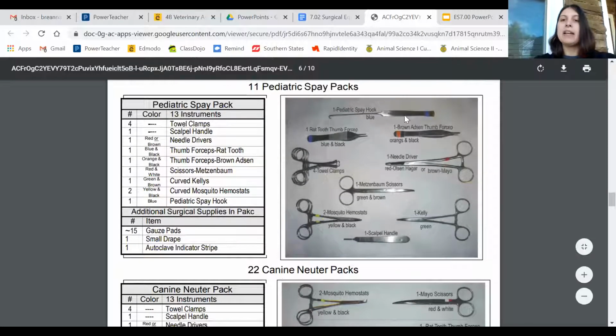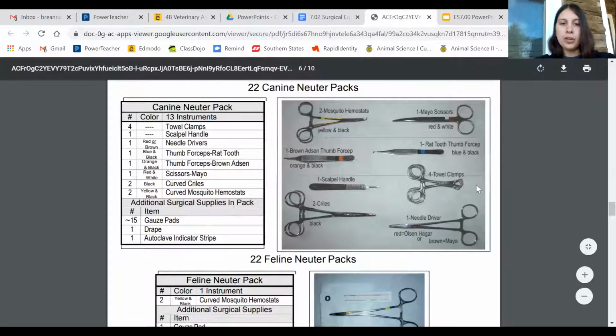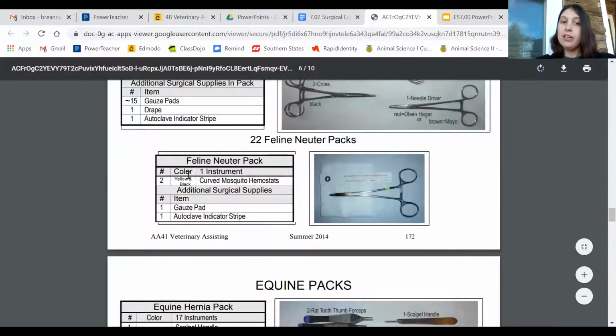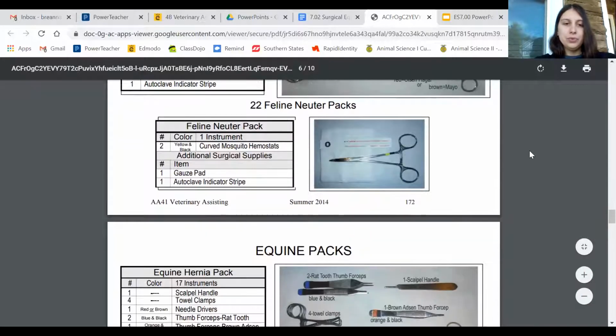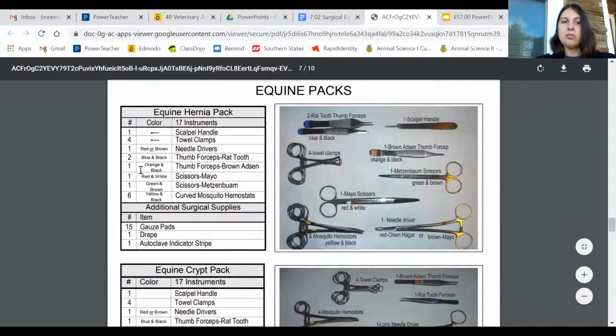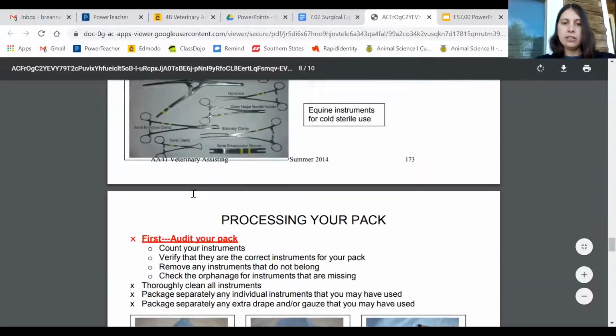Pediatric spay, so spaying a young animal. Neutering. You can see you don't really need a whole lot for a cat neuter pack. Equine hernia, so a horse with a hernia, horse crypt pack.